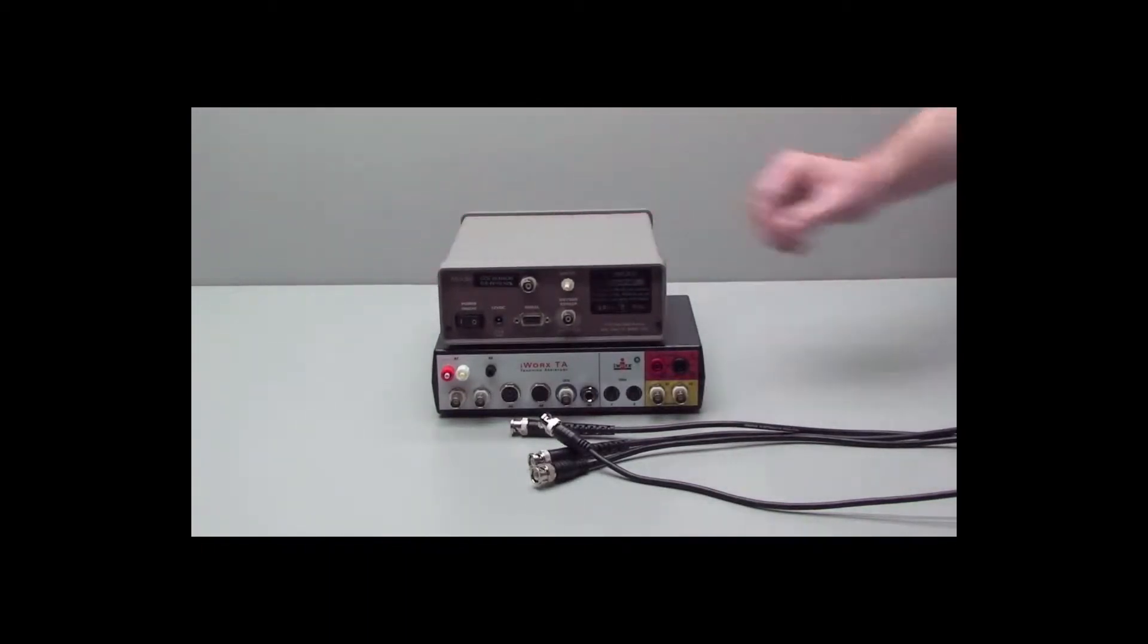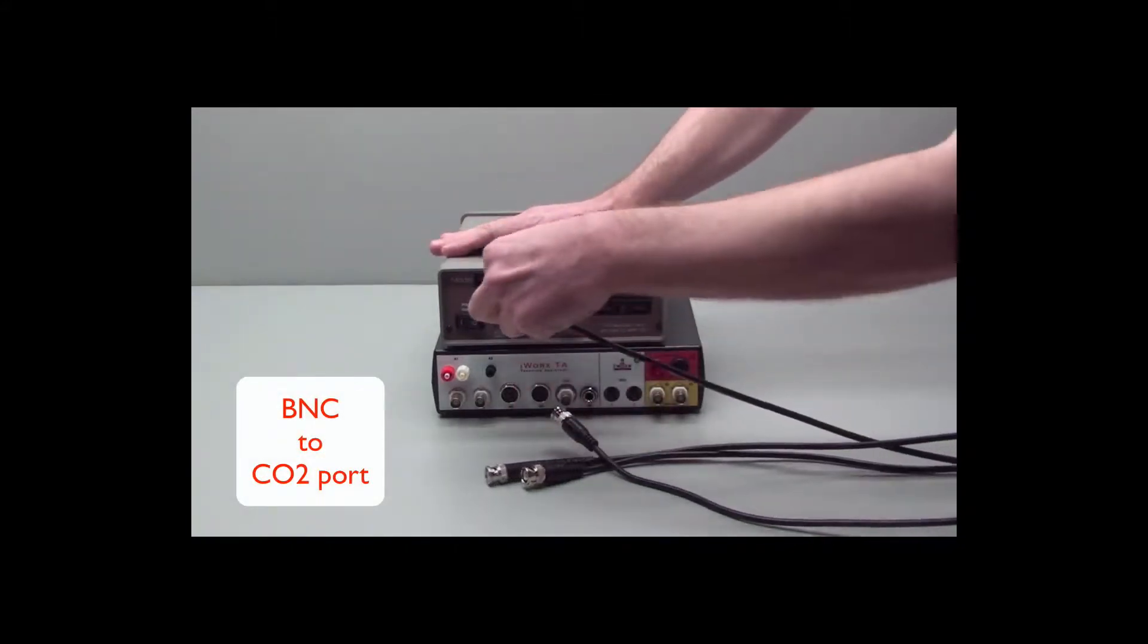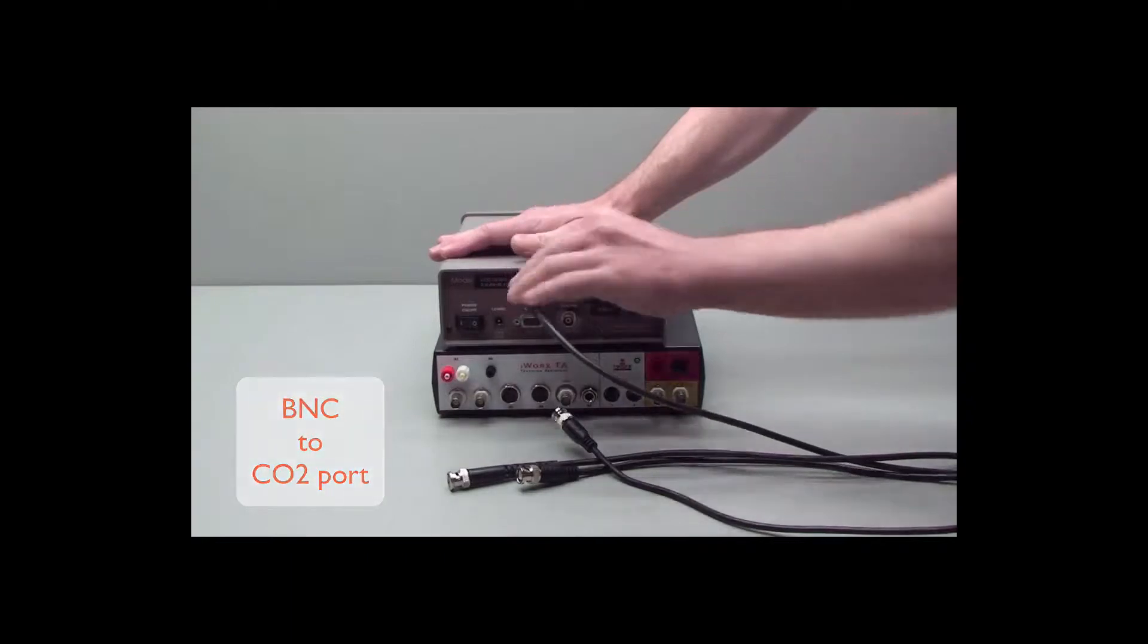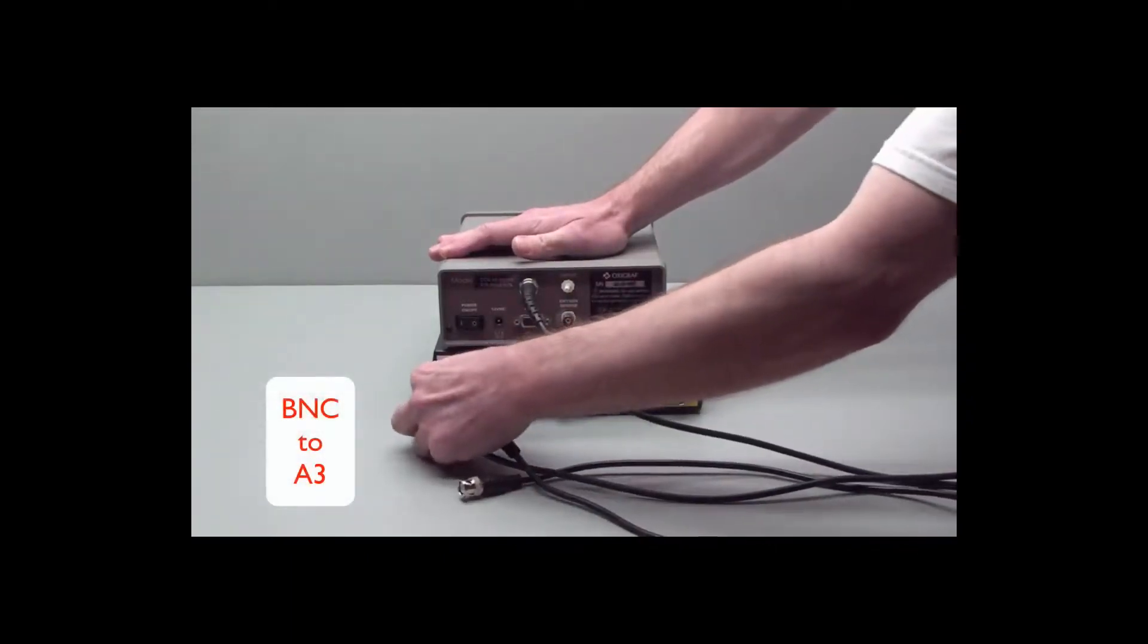With the supplied BNC to BNC cables, take one BNC that goes to your CO2 port, and the other end goes to channel A3 of the TA.